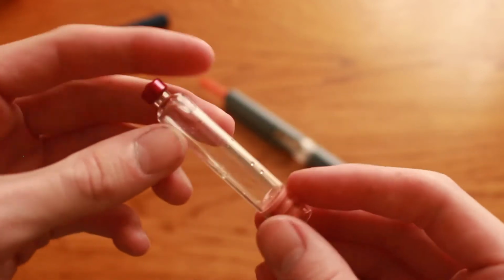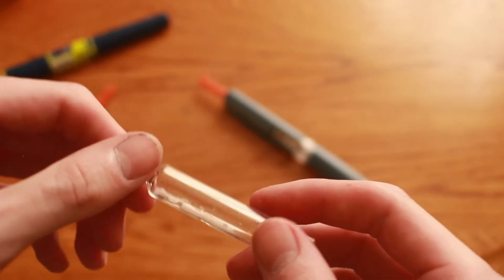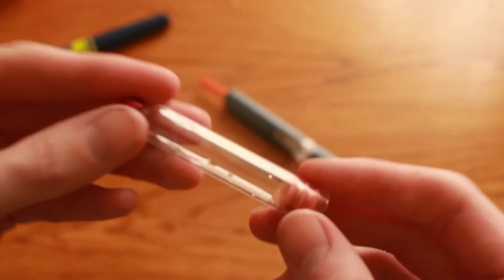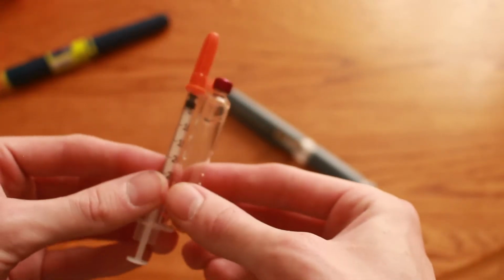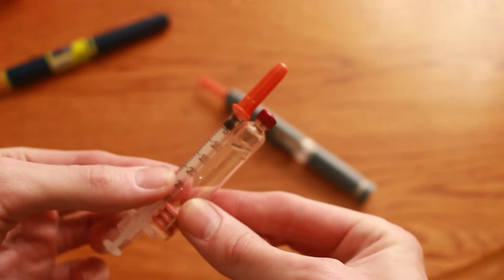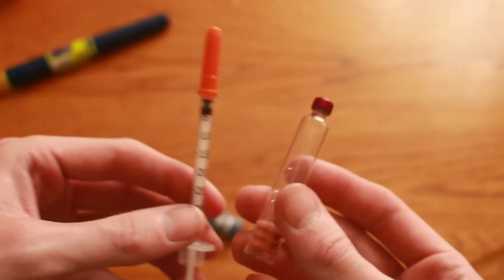Let me show you what I mean. Here is the vial of Humalog that I was able to cut out of the pen. Now you notice that this is a full vial. The pen itself doesn't hold the insulin, the vial does, and the vial is in the pen. Interesting to know. This is a syringe. If you notice, the syringe and the vial are very similar in length as far as the amount of usable insulin space goes, right? Let's do some math here.